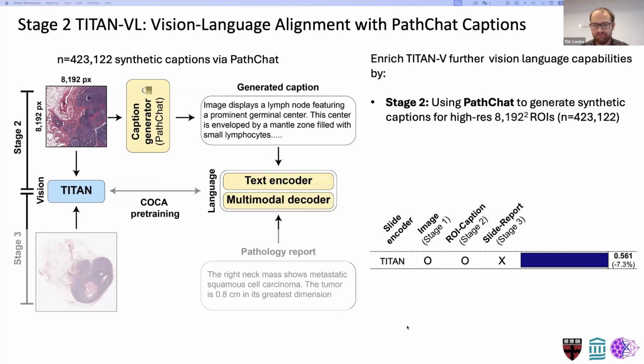Yeah, and so this method gives us several benefits. First of all, it is scalable as compared to the use of pathology reports.